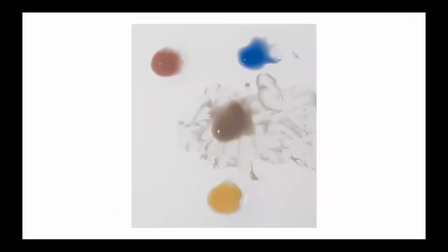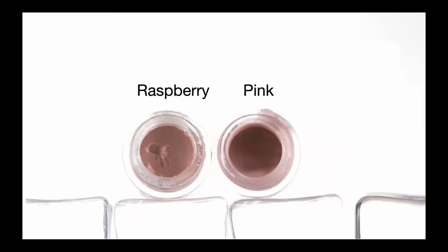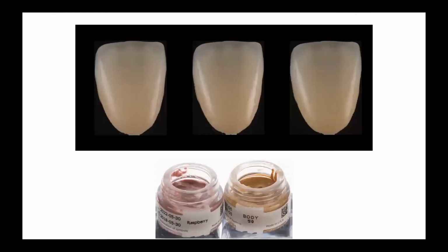The other three important components are red, yellow, and blue. And when we mix them together, we can get the complicated gray. This is the classic mixture, and a lot of authors have written books about this mixture. With the help of complicated gray, we can reduce the value of our restoration without affecting its hue and chroma. And red stains are necessary if you want to achieve good in vivo blending.